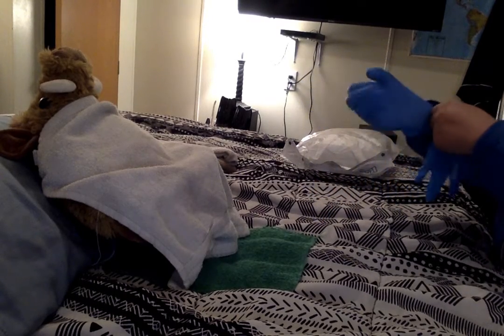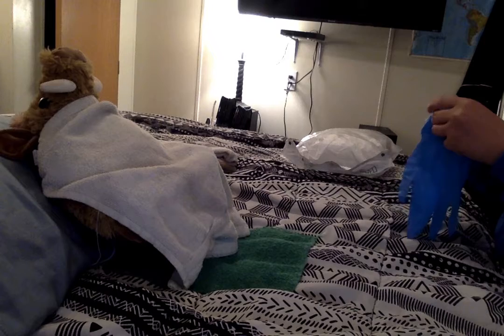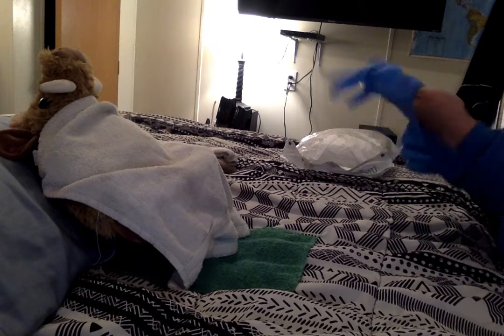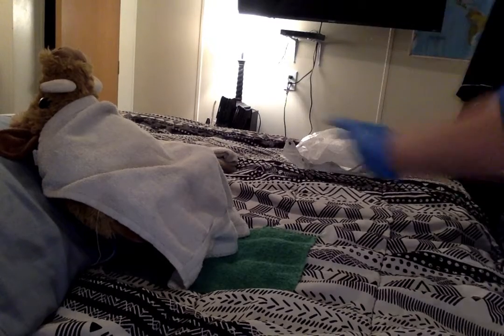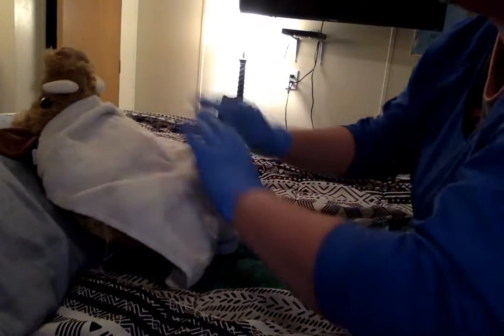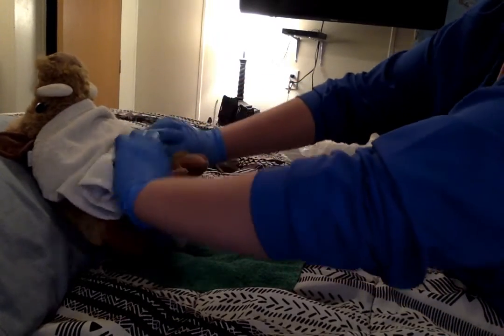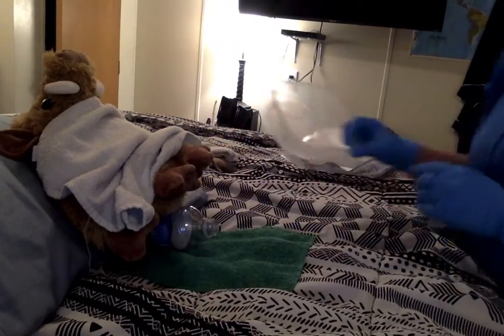So we're going to help the patient into a dorsal recumbent position. We're going to make sure her knees are flexed and relaxed, and she is lying on her back. So we're going to do that now. She's on her back, her knees are flexed. We're going to uncover her bottom.